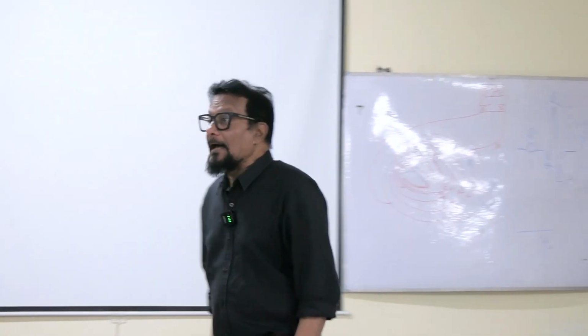So this RR interval is for measuring heart rate. Another thing we also use RR for is to see whether the heart is beating, the ventricle is beating rhythmically, means in the same time interval.